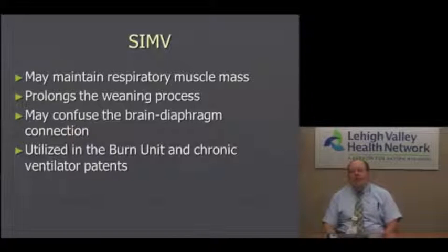And what I mean by that is that the patient didn't know, should they take a breath or should they wait for a breath? And it caused a lot of ventilator asynchrony, and studies showed that not only did it prolong the weaning process, but it also needed more sedation. The patient needed a higher level of sedation and more frequent sedation. So it's really not used much in the acute situation anymore in the critical cares.